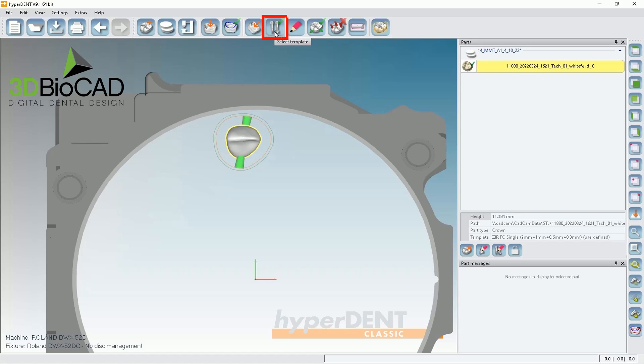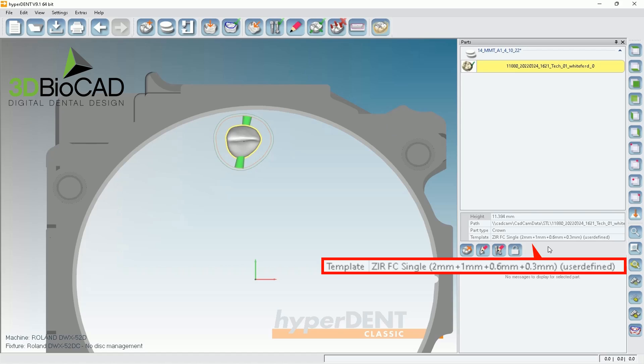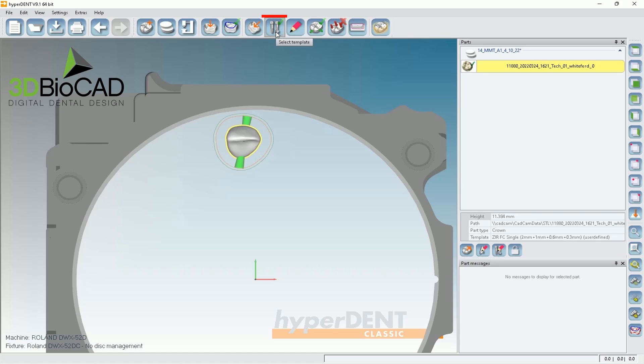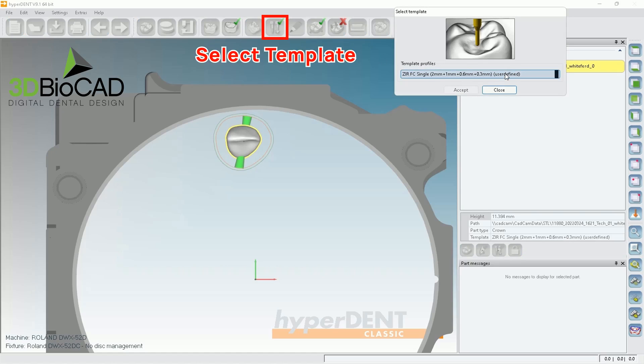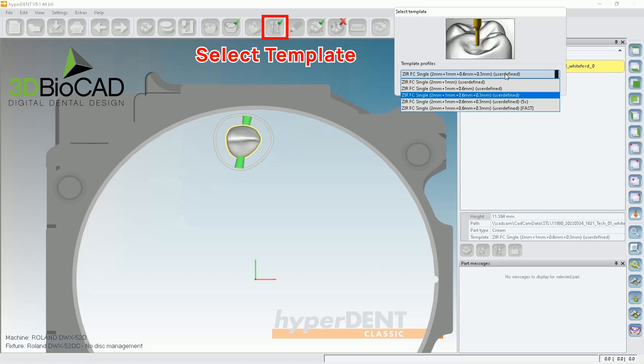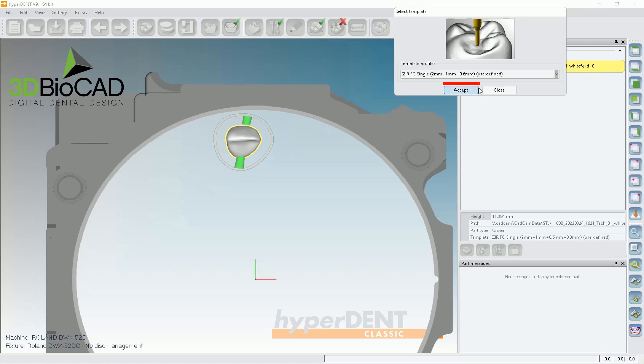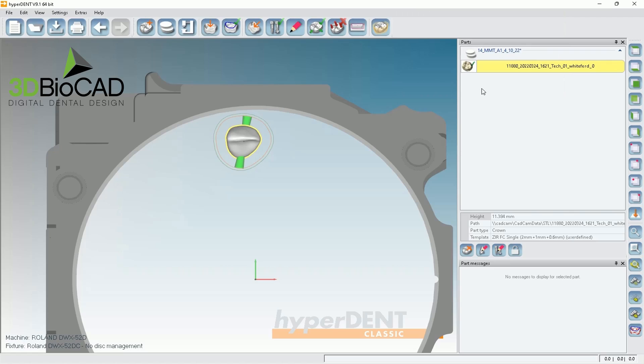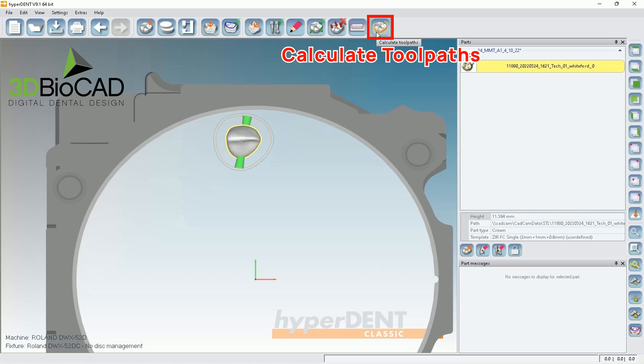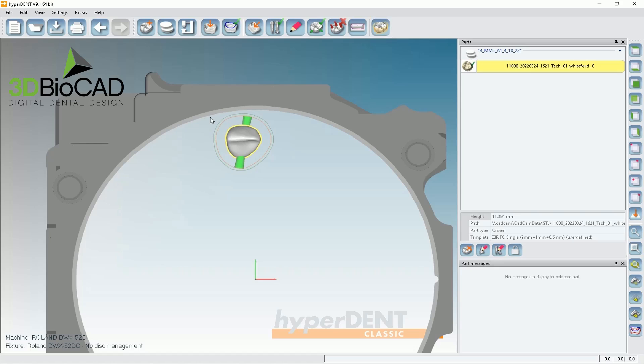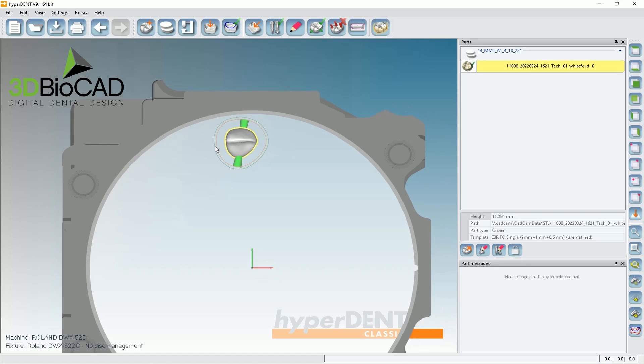So after that, you're also be able to select templates. So please go to select templates. But each restoration type has very has default template. In this case, it'll use two millimeter, one millimeter point six and point three. But if you don't want to utilize 0.3, you can always change and choose 0.6 millimeter template. Click accept and close it. Then you'll be able to click calculate toolpaths in order to start the calculation. But I want to show you a different type of restoration, too, together.